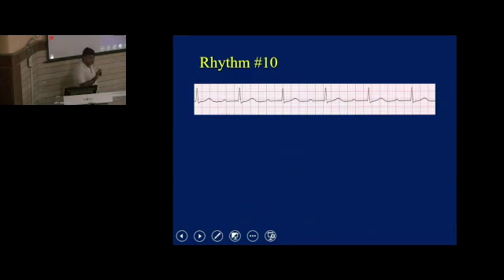We say that, am I clear? Normal upright P wave followed by a QRS complex. So here we say that this ECG is showing normal sinus rhythm, okay, with a rate of around 60 beats per minute and a regular rhythm. Okay, till now all is normal. Let us proceed further. P wave is normal, QRS complex is normal, isn't it? T wave is normal. So all the waves are normal.